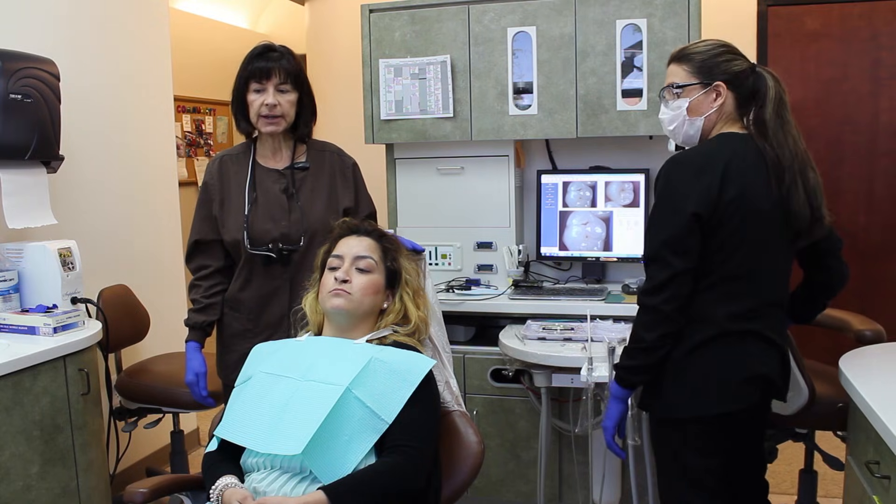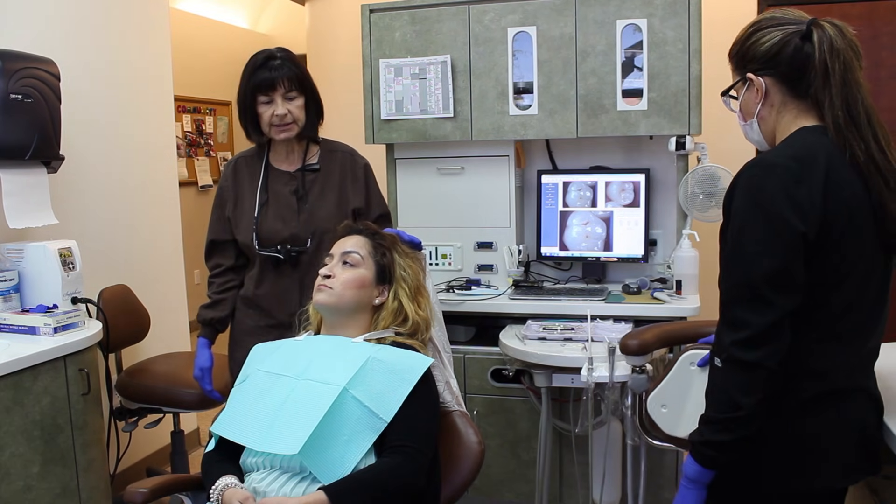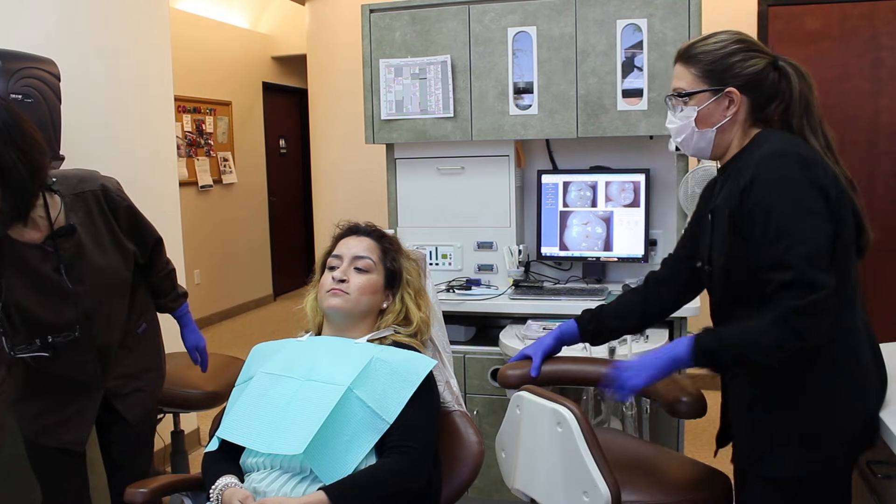Alright Julie, I'm going to go ahead and lean you back and we're going to do the air abrasion procedure and take care of your cavities. Can we get her some safety glasses please?